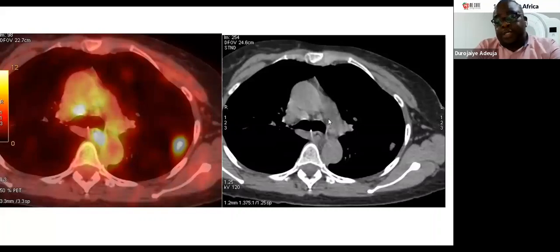So this shows an advantage that the PET-CT offers, especially when you are looking at the CT image and you're not exactly sure if there is really a suspicious lesion. This brings it out. This is also a hypermetabolic nodule that we saw in the earlier image.